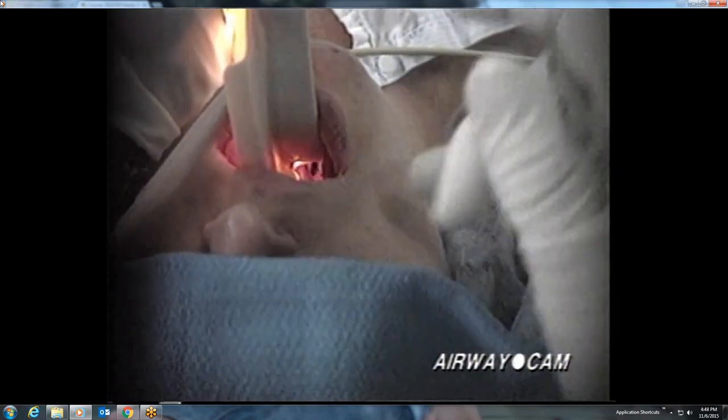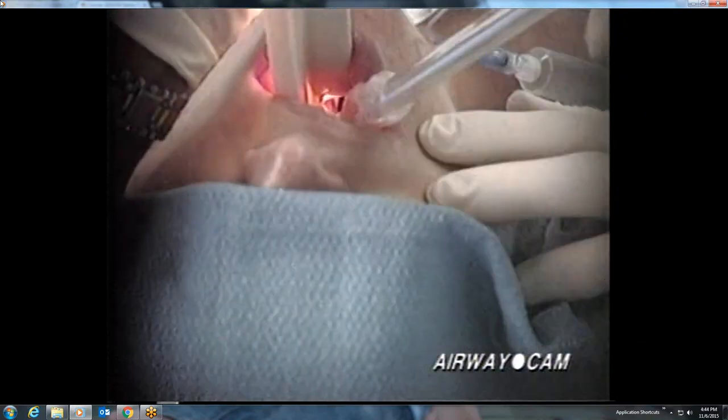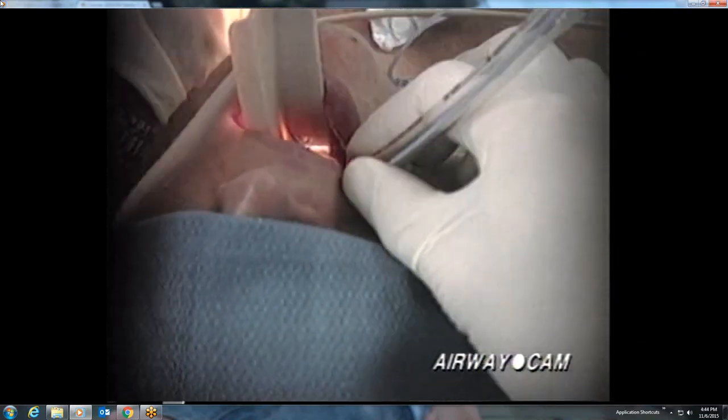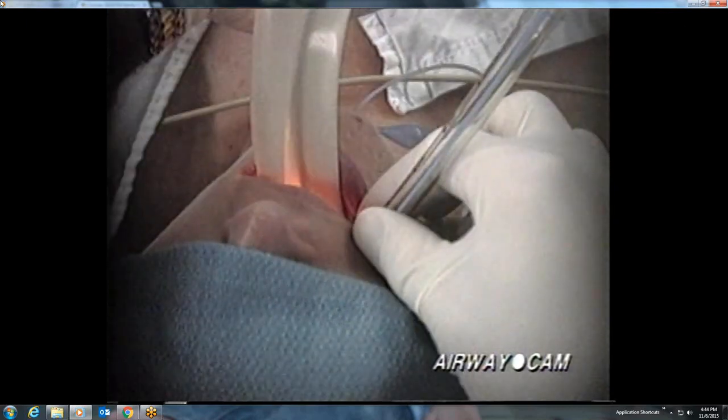larynx. The endotracheal tube is carefully guided down the right side of the mouth into the glottic opening, and the tube is stabilized at the lip line. The tube should be inserted to 21 centimeters at the incisors in women and 23 centimeters for men.